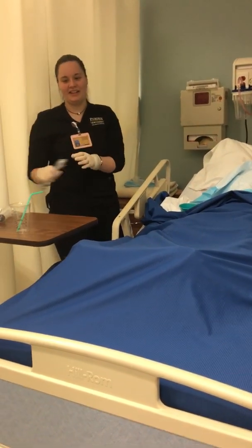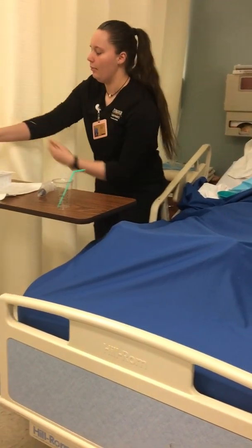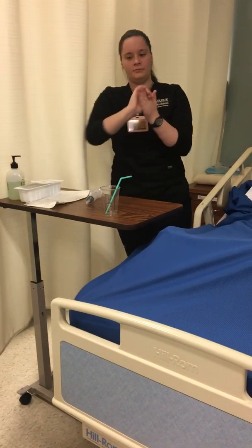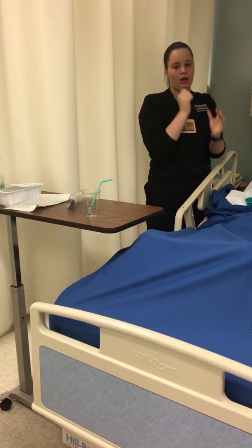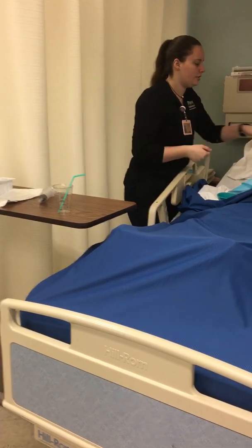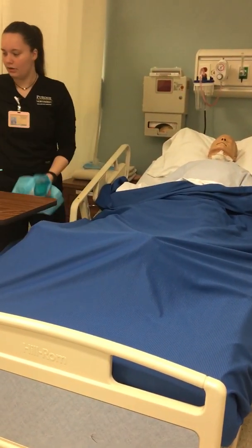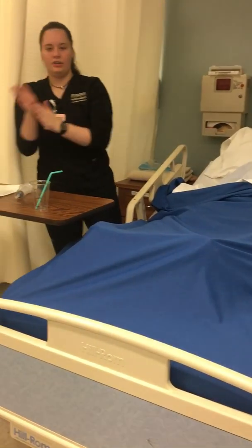Then I would remove my gloves and perform hand hygiene. I would offer oral care if they wanted it — this patient does not. I'd get rid of all my supplies.